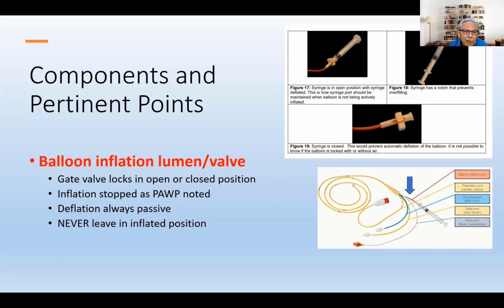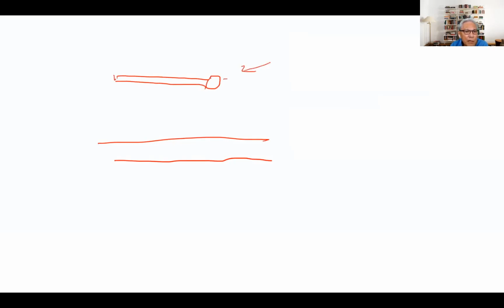So if this is the tip of the catheter right here, the balloon when inflated will move forward slightly like this. And what is the purpose of that balloon? The purpose of that balloon is to underscore the principle upon which it's going to detect something. If I have a catheter right here and there is an opening right there, I can measure pressures coming from here, also pressures that are coming from this area.